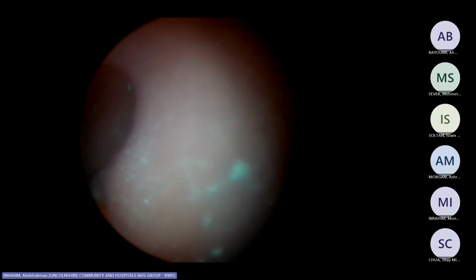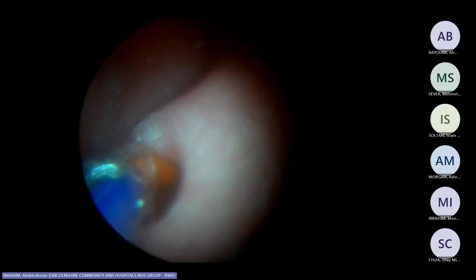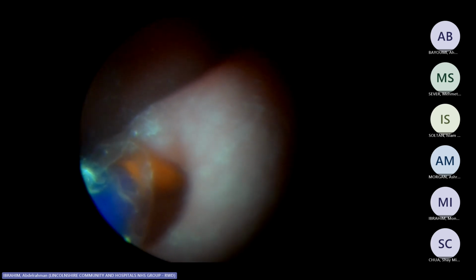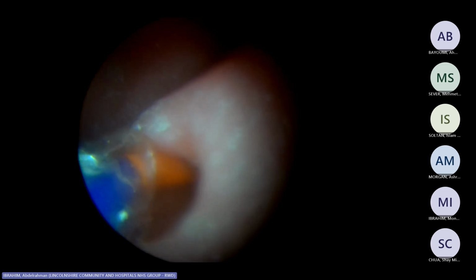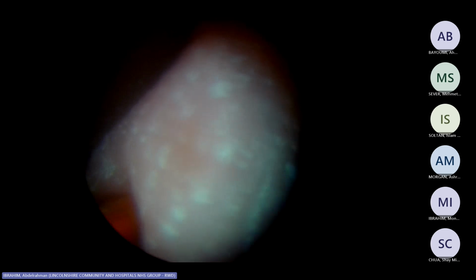So use less pressure and go with the natural flow of the eustachian tube. You're just dilating the eustachian tube. You don't want to do much injury. Then you start inflating it, and after you finish, you withdraw this out.